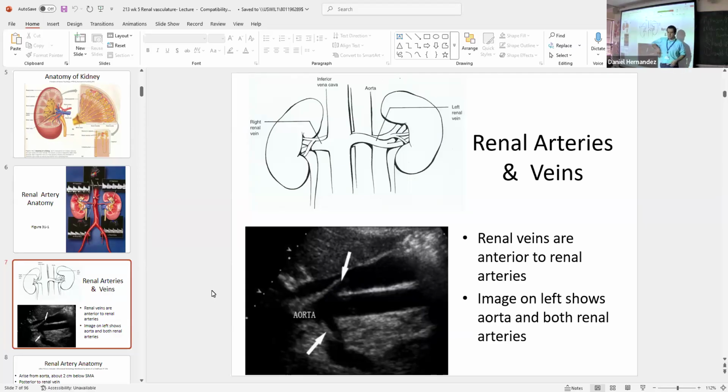So they're probably taking a right coronal approach. If I'm coming right coronal, that renal artery is coming up towards my transducer. So it's running more towards my image or towards my transducer, where the other one is going away from me. I'm coming from that right coronal approach. It's going towards the left.